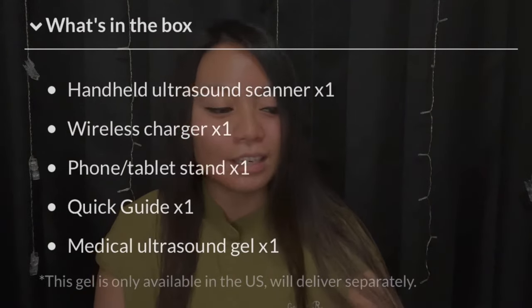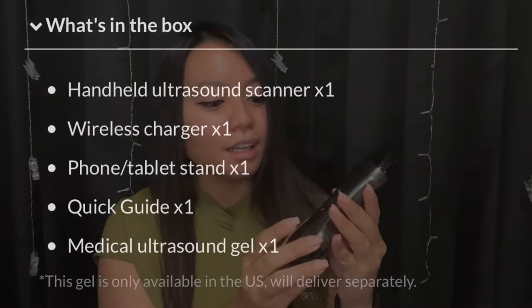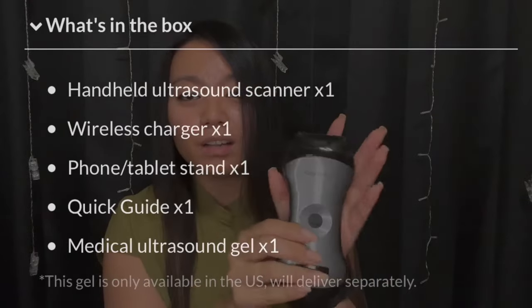I'm sure you guys are wondering what's in this box. I love that it's very simple and user friendly for anyone who's going to purchase this probe. When you open the box, what you're going to receive inside is the actual probe itself. Here's the probe and you can see that it's pretty small — it's a dual-head probe, meaning there's a curved probe on one side and a linear probe on the other side.